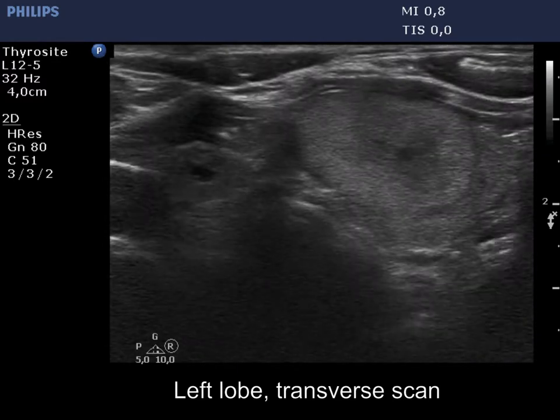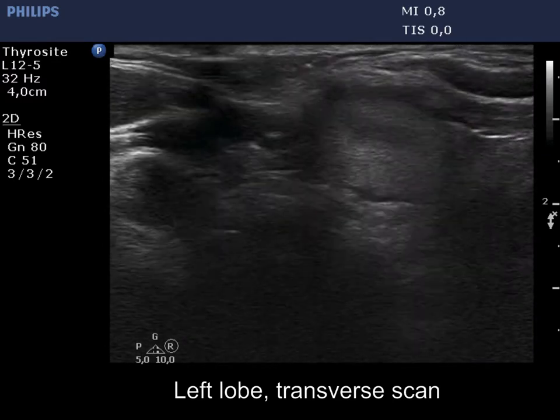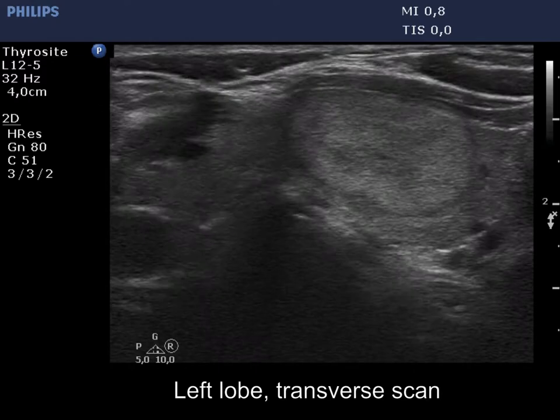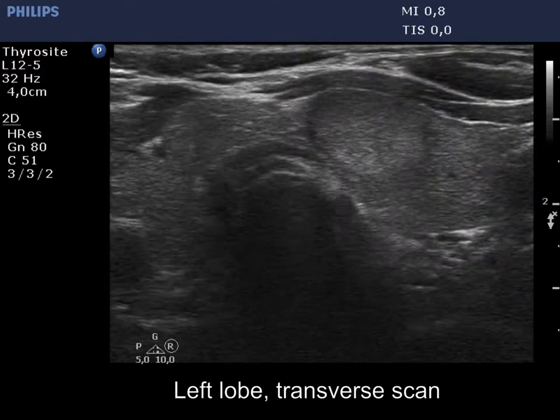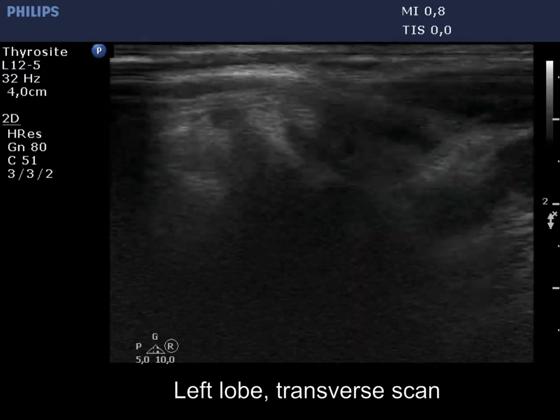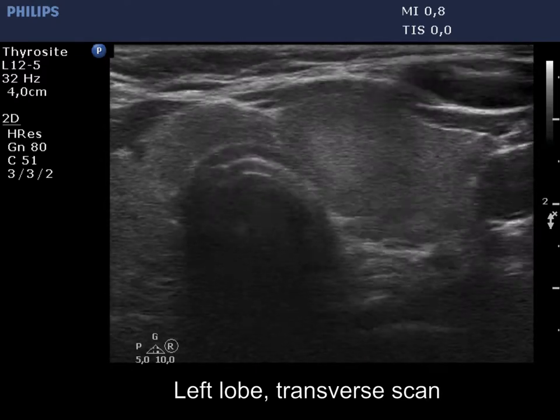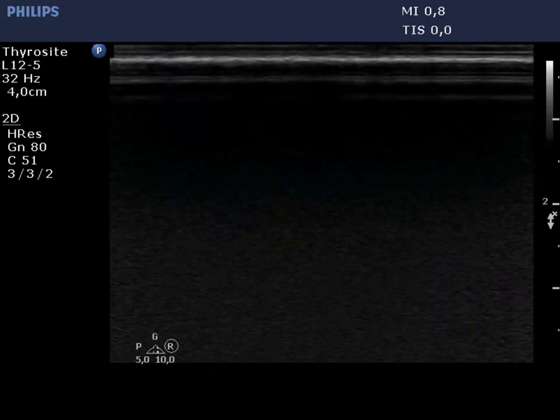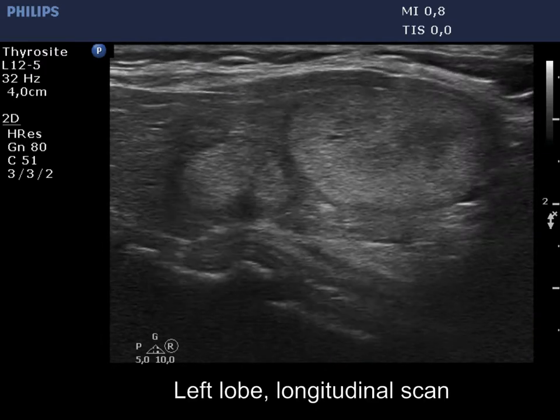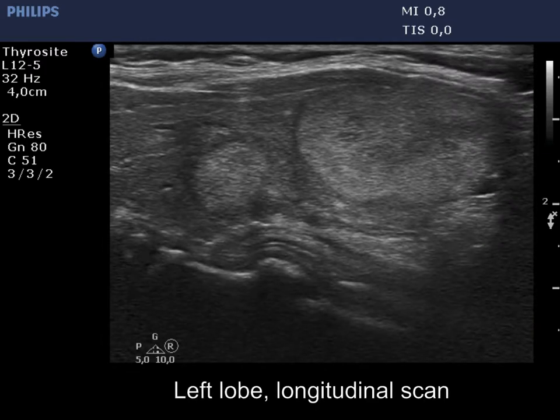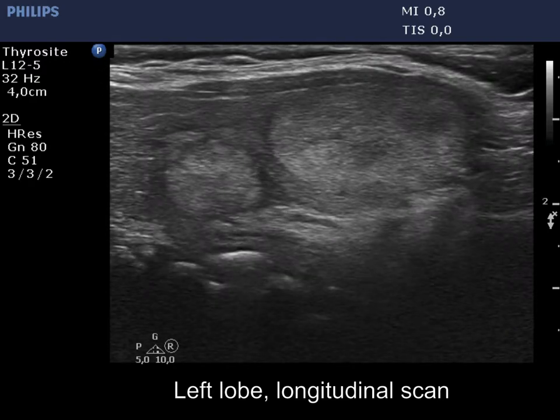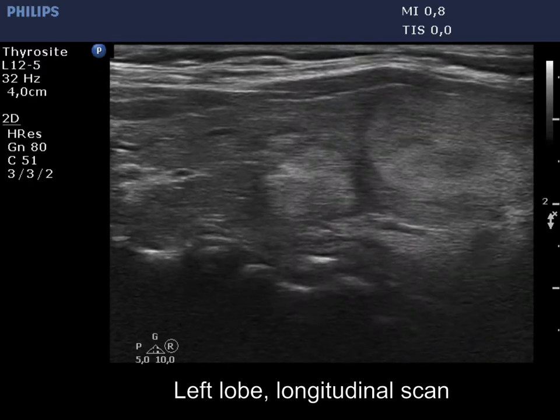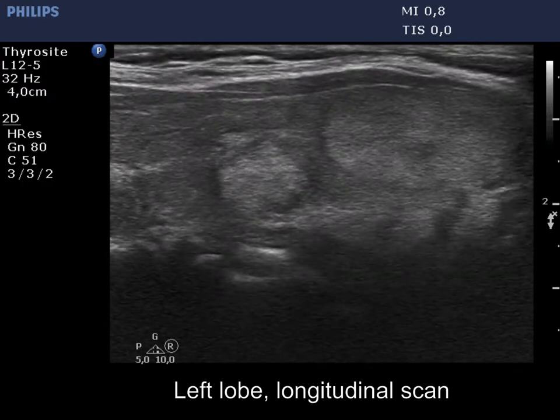There were two nodules in the left lobe. Both were hyperechoic and showed halo sign. Indeed, the larger one was a heterogeneous nodule with a dominant isoechoic to hyperechoic part. The smaller lesion shows irregular borders, but this is likely caused by the infiltration of the thyroiditis, which means that the lobulation is not pathological.